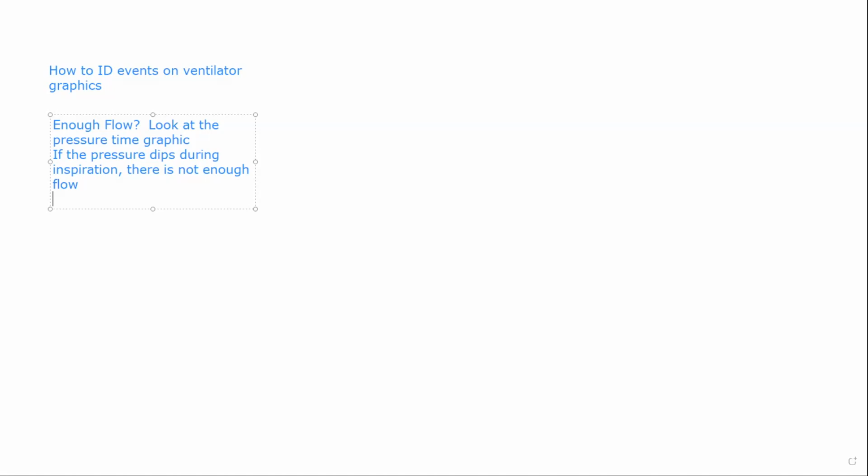All right, so now to draw what that looks like when you're looking on your graphic. So in a volume mode of ventilation, we know that, let me look at the graph here. In a volume mode of ventilation, pressure builds throughout inspiration, then the exhalation valve opens, and then the pressure goes back down to baseline, whatever it may be. Volume.